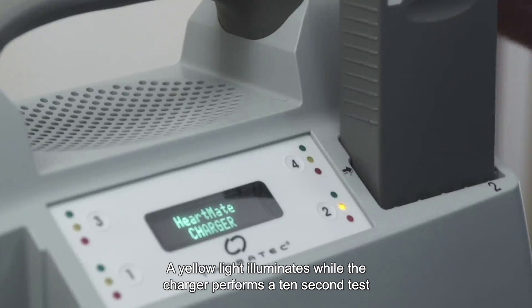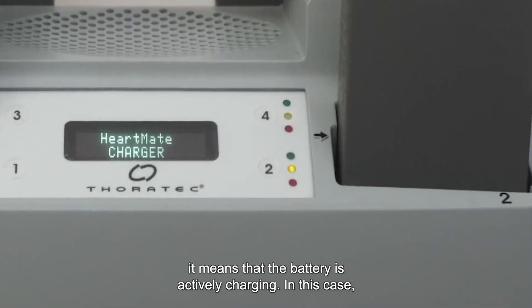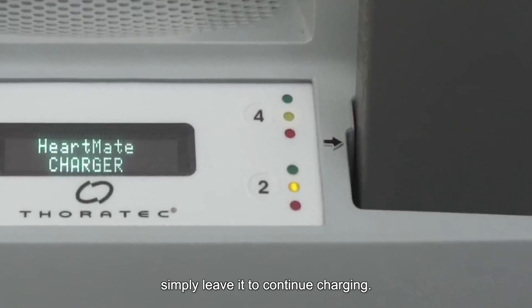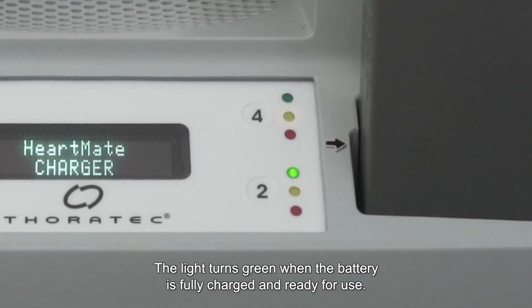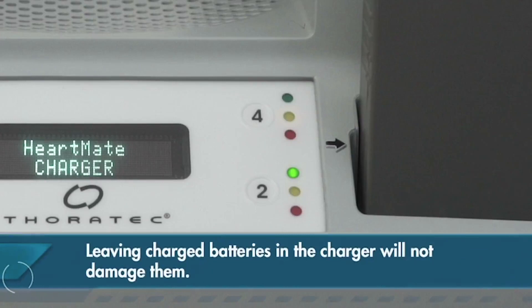A yellow light illuminates while the charger performs a 10-second test to check the battery. If it remains yellow, it means that the battery is actively charging — in this case, simply leave it to continue charging. The light turns green when the battery is fully charged and ready for use. You may either remove it or leave it in the pocket until needed. Leaving charged batteries in the charger will not damage them.